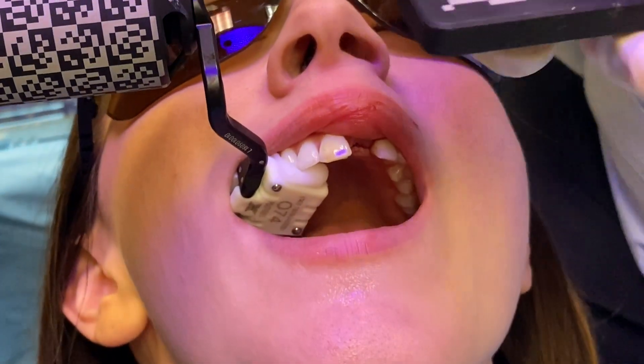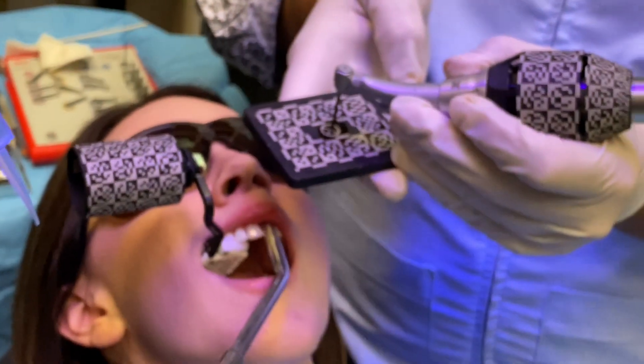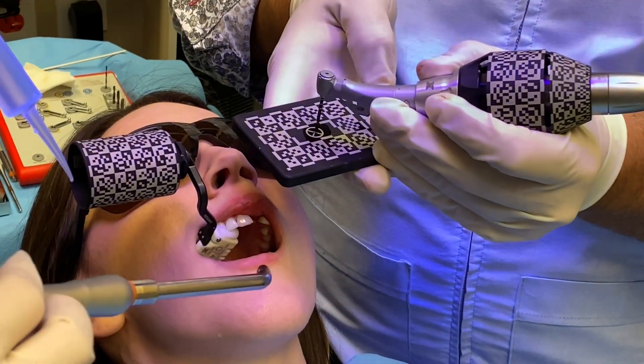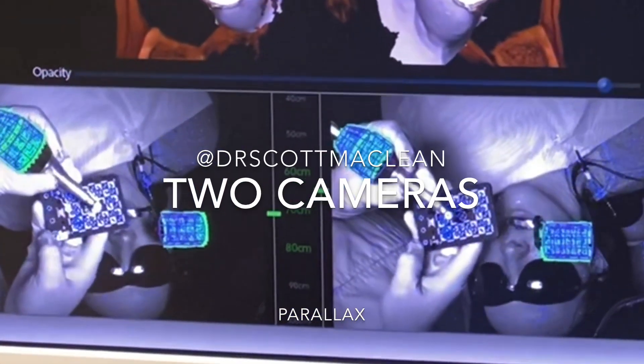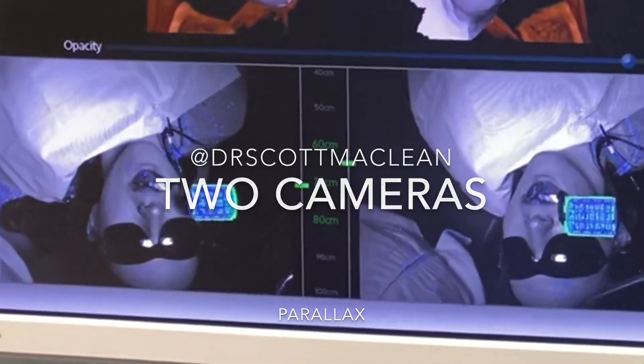We're going to take this and measure the drill — measuring the depth of the drill. We've got a tracker on the handpiece and also a tracker on the patient. Then they calibrate these using a two-camera system, so you can see my hands kind of looking right down through the camera itself.